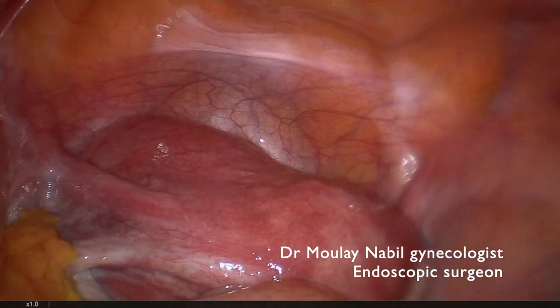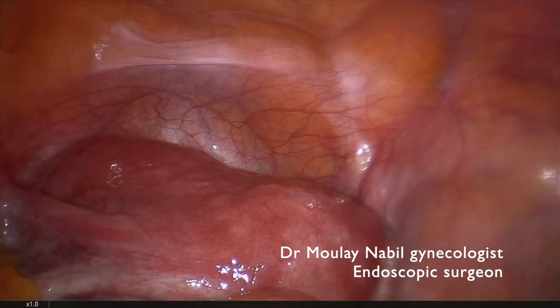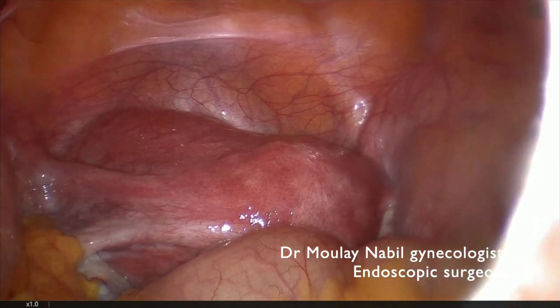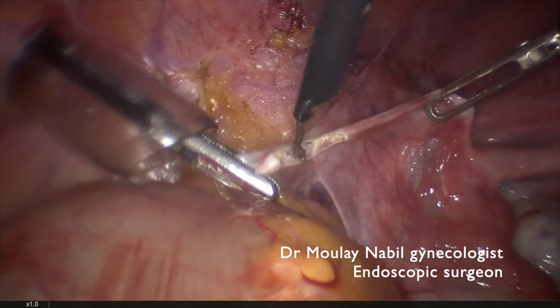This is a case of a huge 10 cm left marginal myoma and we will do a standard laparoscopic myomectomy with previous vascular control.